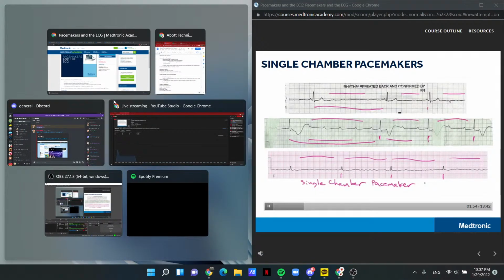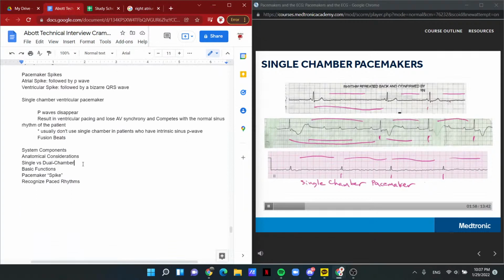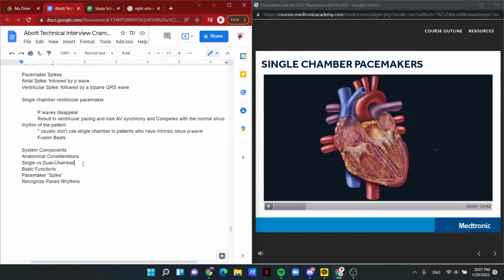We'll talk about how these pacemaker systems work later on in this video. But for now, let's review how pacemaker systems are constructed. In this illustration of the heart, we can see the 4 chambers as well as the electrical system.